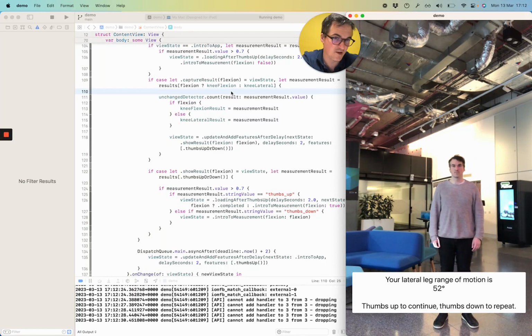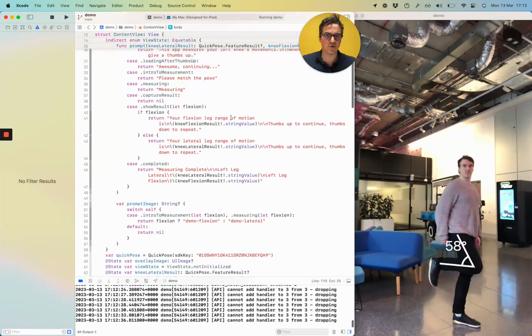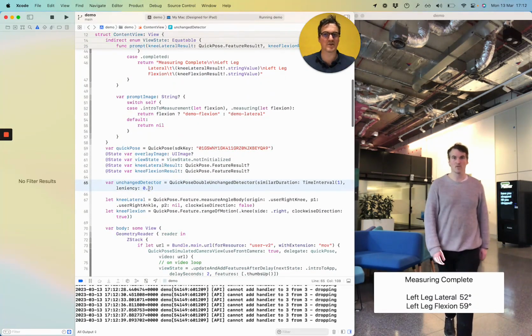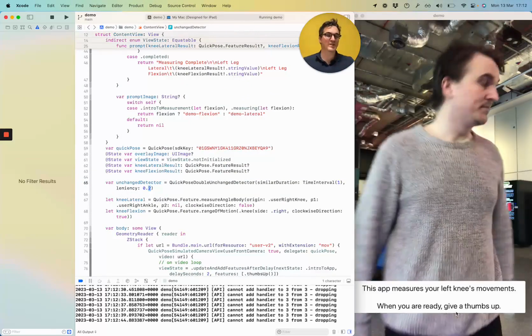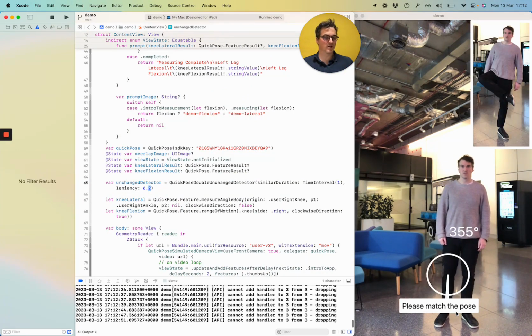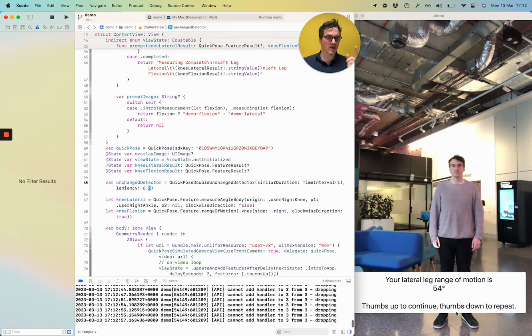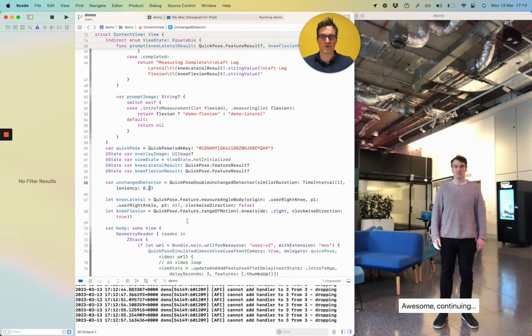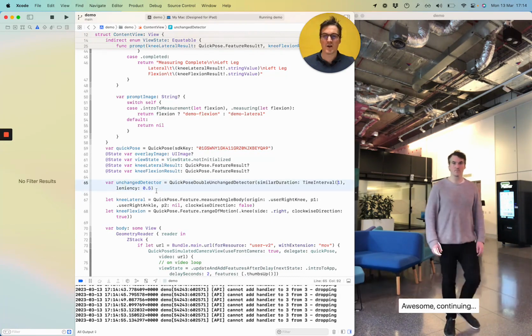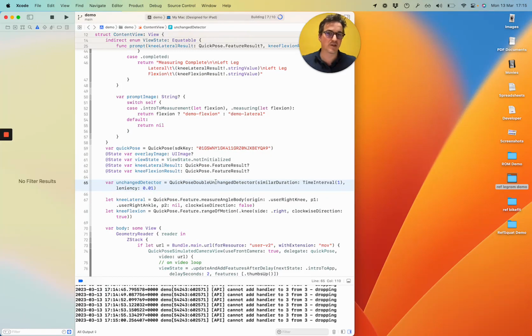52. Well, I don't quite know why it's chosen a lower number. Let's have a look. So the leniency might be too high. So the leniency says it needs to be a 20% value, and for a range of motion, 20% is actually quite high. 1% of 100 degrees is 1 degree, and we're dealing here with 50 degrees. So I'd say for each percent of leniency, you're looking at half a degree, and I've got 20% of leniency, so it's plus or minus 10 degrees here. Probably the key thing I want to show you here is the lower the leniency, the stricter it is, and there's a chance it won't work.